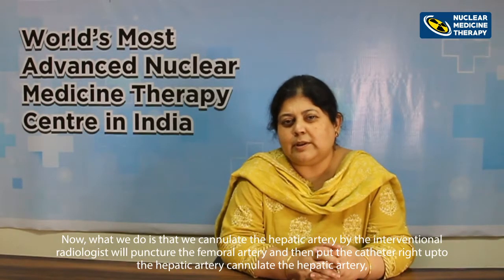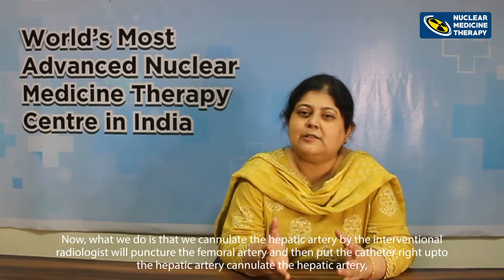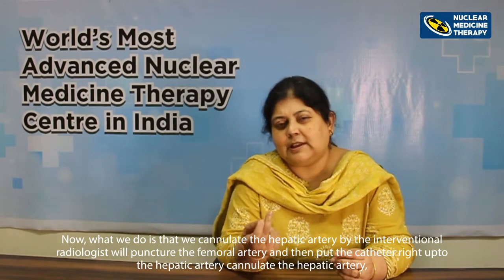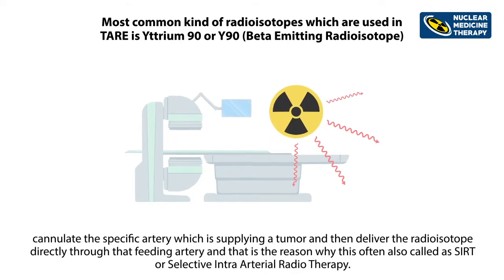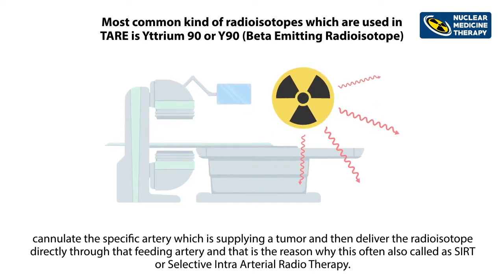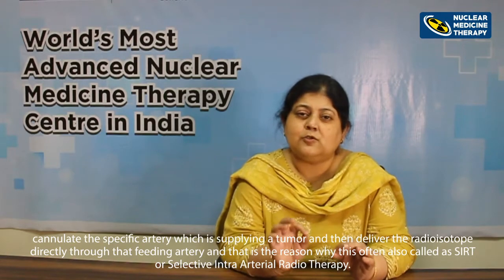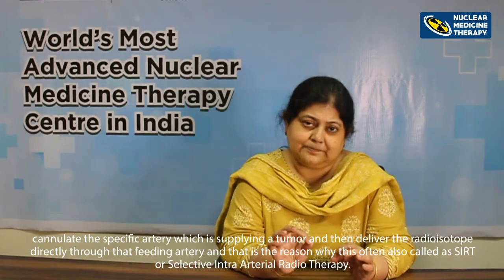Now, what we do is cannulate the hepatic artery. First, the interventional radiologist will puncture the femoral artery and then put the catheter right up to the hepatic artery, cannulate the specific artery which is supplying the tumor, and then deliver the radioisotope directly through that feeding artery. And that is the reason why this is often also called SIRT, or selective intra-arterial radiotherapy.